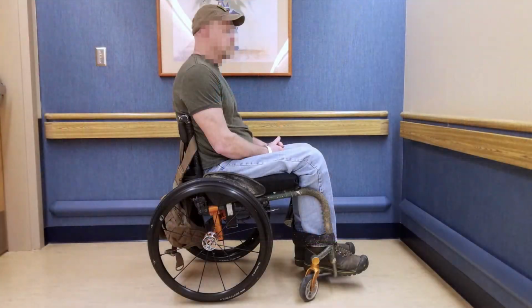Probably requires some adjustment somewhere else because he uses the backrest clearly, because he's slung way into it. I try to give him some support, but yeah, that might be an issue. So I'm able to foresee that, so I'm working on contingencies if it doesn't work. Actually, I ordered regular upholstery just in case, because he may not have that ability to bridge over. And we had a couple cases that we took out for time constraints.